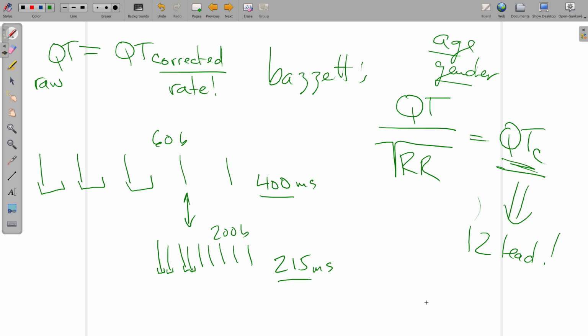So I'm going to say the QTC is said to be long in the adult patient if it exceeds 440 milliseconds, right? This is a rough number. It might be 460, it might be 420, it might be 480. 440 is a reasonable number for us to use. It's a good number for us to use. All right, so remember we started this whole mess back with polymorphic VTach.